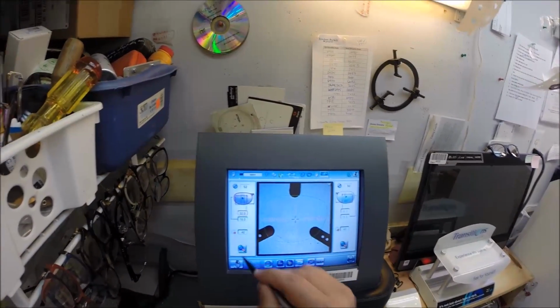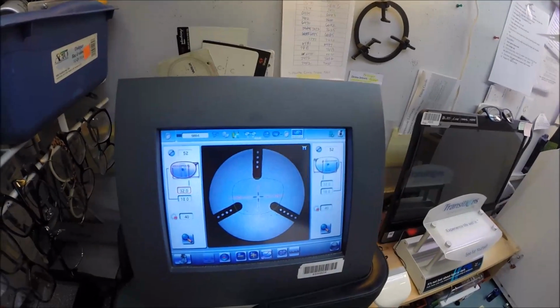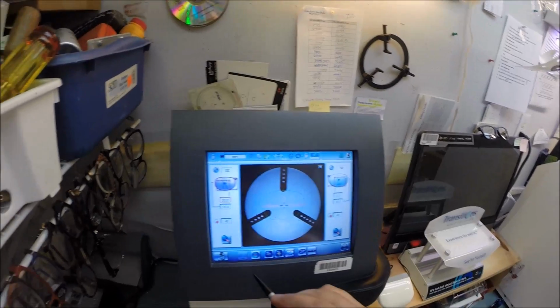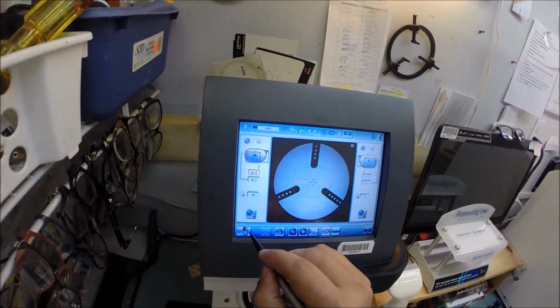So that is the shape of the lens. We'll cut only magnified. If I will minify, here's a good chance. Go look up the word minify. It is not in the dictionary, but there has to be an opposite to magnify, right? So, speaking of magnify, let's magnify that back to the original size.